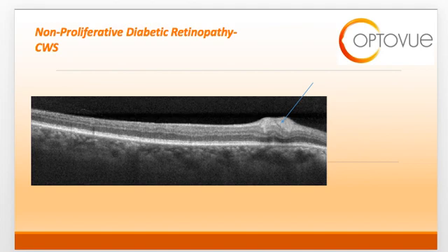This OCT shows a cotton wool spot. Remember that a cotton wool spot manifests as a result of a nerve fiber layer infarct. When you look at the OCT, you can see the hyperreflective area affecting the nerve fiber layer, thus manifesting as a cotton wool spot.